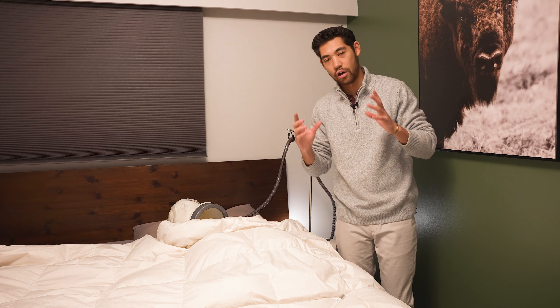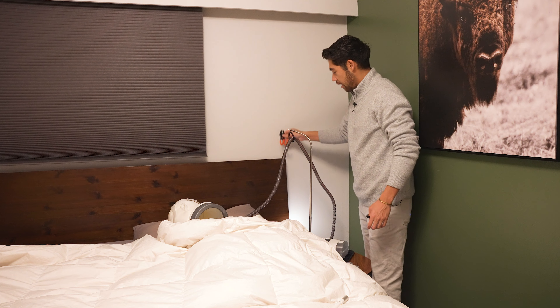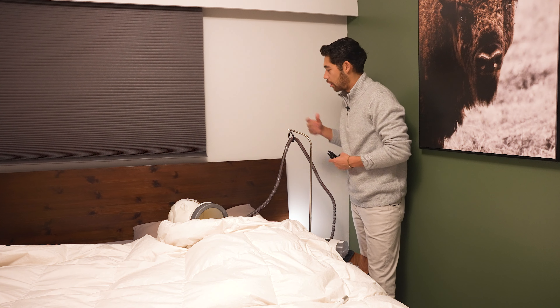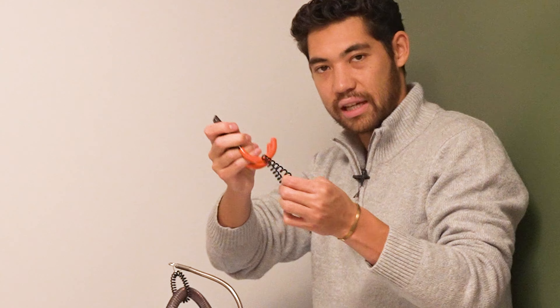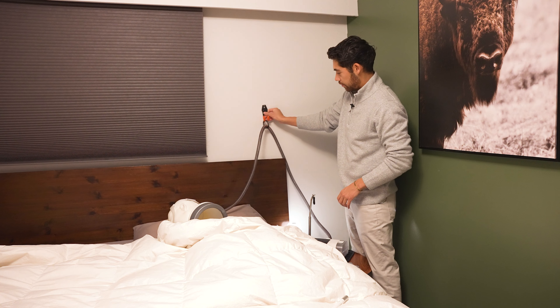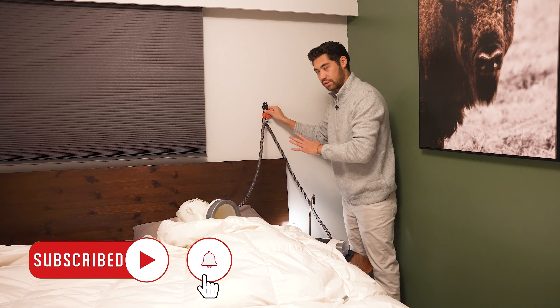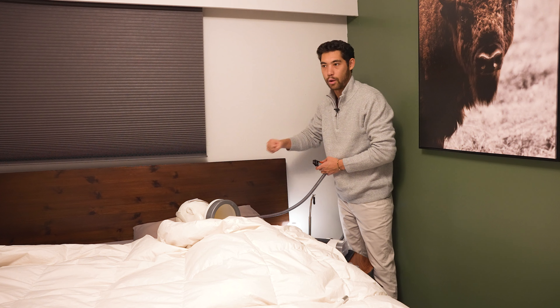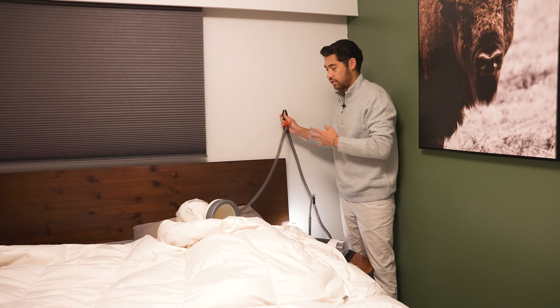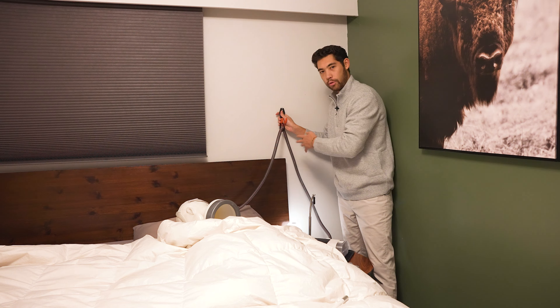Another option is a homemade or more simplified solution: just get a hook like this from any hardware store. You can get a much smaller hook to make it nice and discreet, and basically bolt it anywhere you see fit. You might have your partner hold the tube so you can figure out where you want it before you bolt it in, since it's gonna leave a hole in the wall. Or just get a little thing from the dollar store and put it on the wall or bed frame. The same type of deal — just with a simple hook. The problem with the hook is it doesn't move as much. With the Raptor you can bend it however you want, giving you flexibility. This hook design is pretty stagnant unless you have a few different hooks along the wall, but it does look very discreet and keeps your tube out of your face.